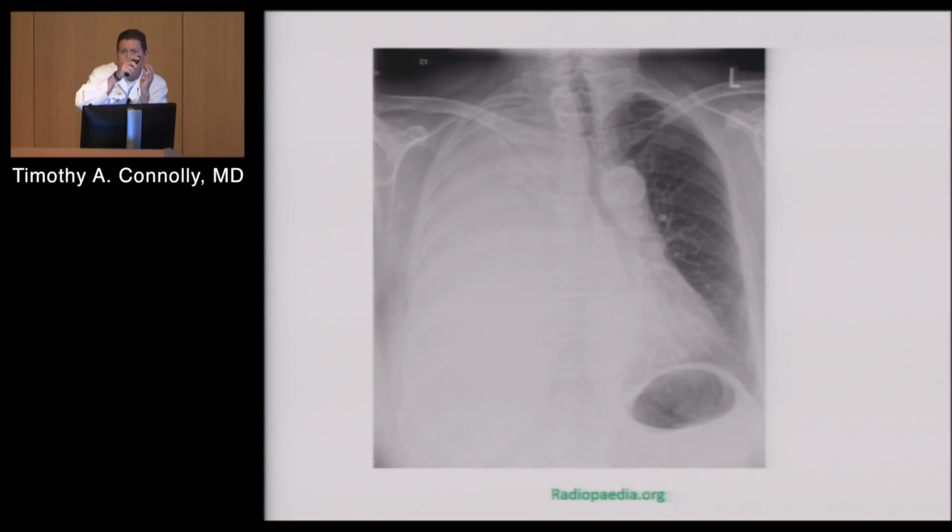Their lung has been pushed down to a little nub. And so even though we still use ultrasound, we probably don't need to. You can just throw a dart from across the room and that's going to work.